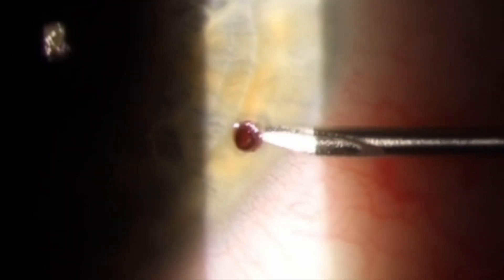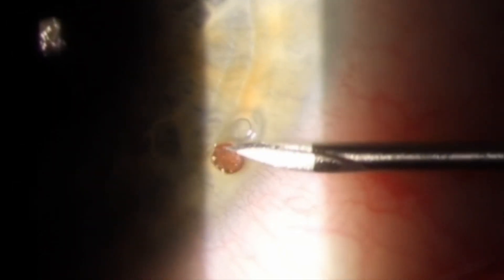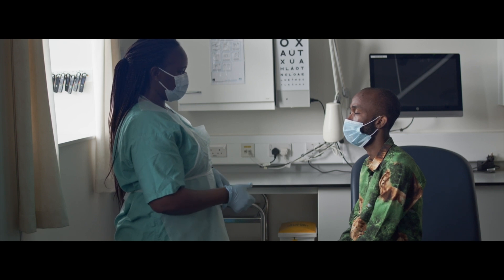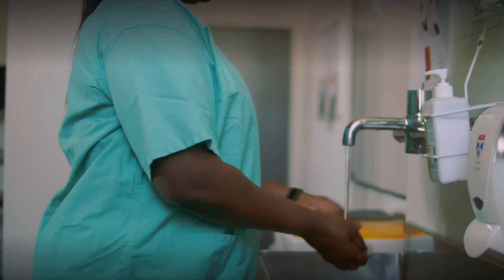This video demonstrates how to remove a corneal foreign body. You will need local anesthetic, clean fluids such as saline, a cup, cotton bud, and a needle. Prepare all the equipment, explain what you're going to do, and gain consent.